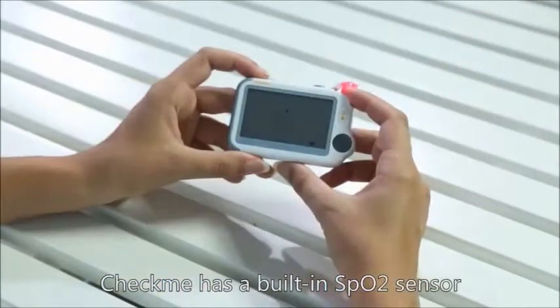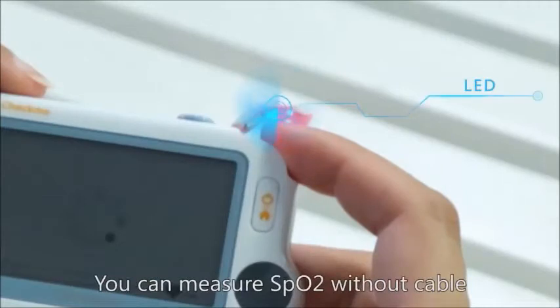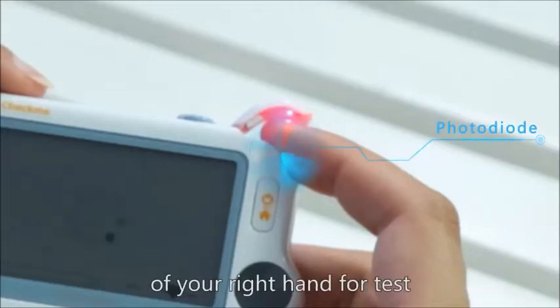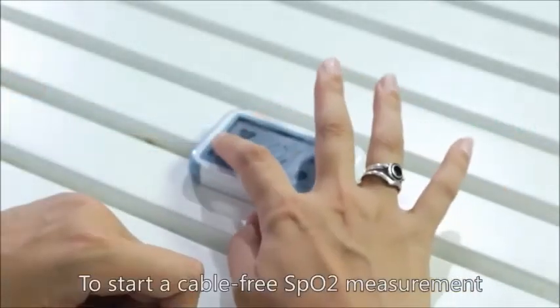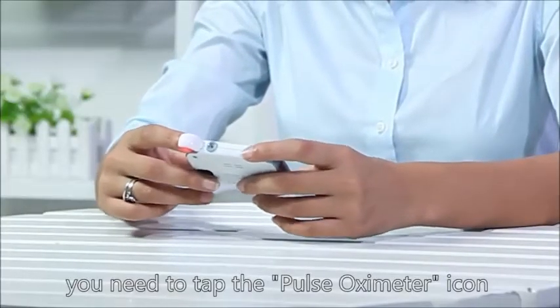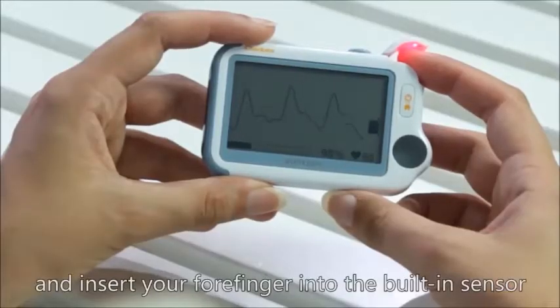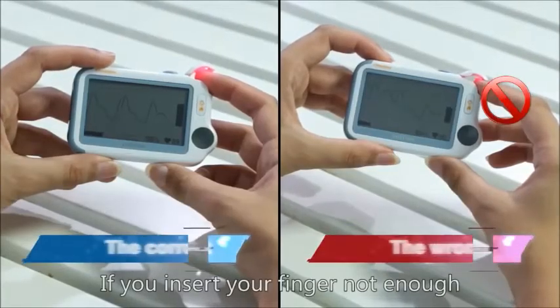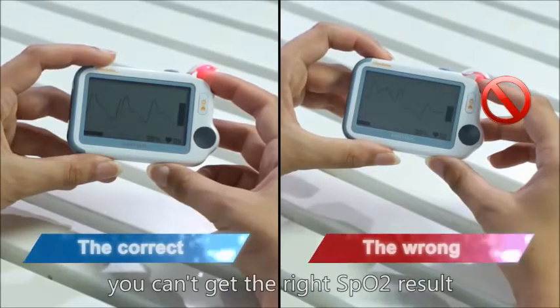CheckMe has a built-in SpO2 sensor. You can measure SpO2 without a cable. Usually, you can choose the index or the middle finger of your right hand for testing. To start a cable-free SpO2 measurement, you need to tap the pulse oximeter icon and insert your forefinger into the built-in sensor. If you don't insert your finger enough, you can't get the right SpO2 result.